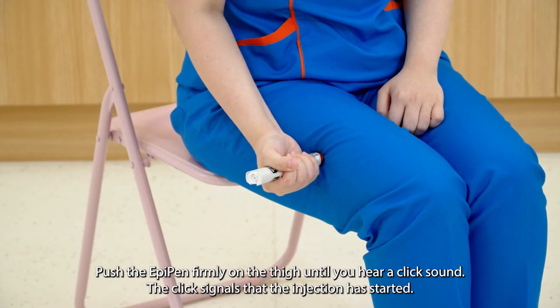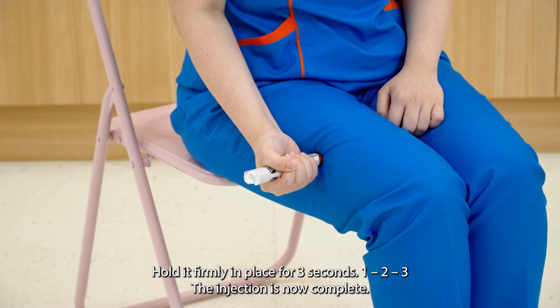Push the EpiPen firmly on the thigh until you hear a click sound. The click signals that the injection has started. Hold it firmly in place for three seconds: one, two, three.